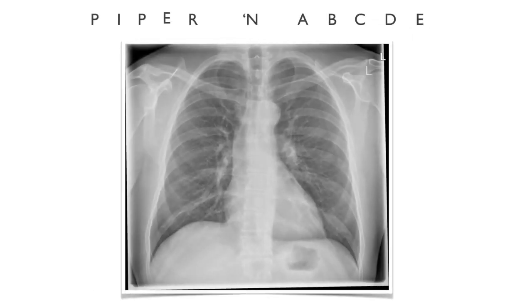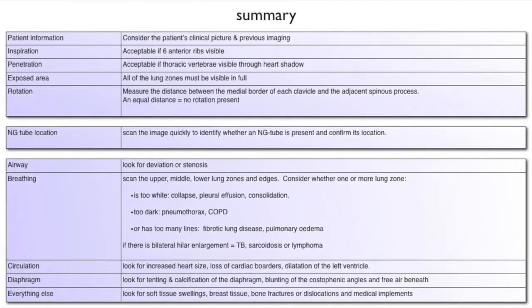This concludes our review of the Piper N ABCDE Mnemonic. We've covered an awful lot of material, so here's a useful summary for you to pause and print.